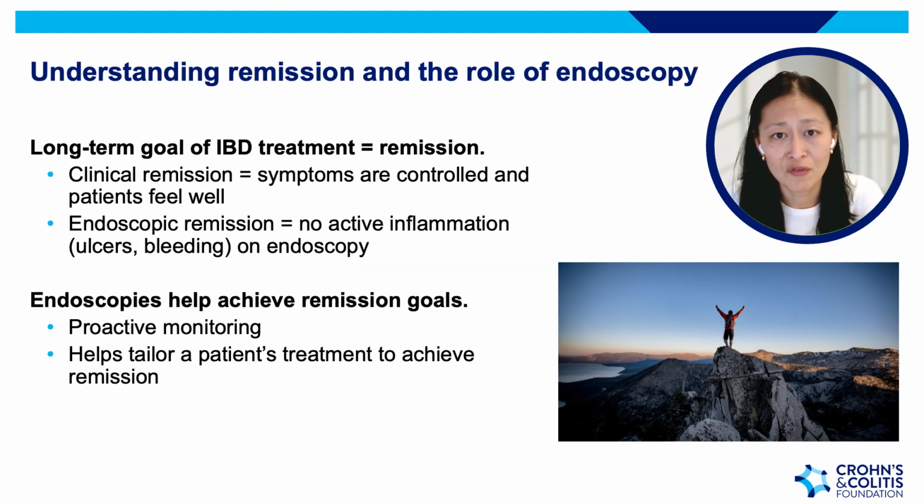The long-term goal of IBD treatment is going to be remission. So a lot of my patients will say, what is remission? Well, there's different types of remission. So one is clinical remission, where your symptoms are controlled and you feel well. And then there's endoscopic remission, where there's no active inflammation when you look on the endoscopy. And again, endoscopies help us to achieve these remission goals because we're proactively saying, okay, well, you feel well or you feel pretty good, but how does it actually look inside? And do we need to make any tweaks or changes to your medications to try to get you to the best that you can be? And it also helps us tailor a patient's treatment to achieve that remission.